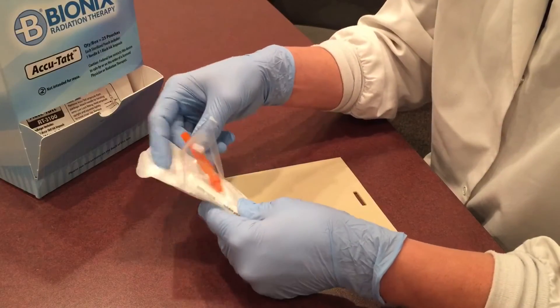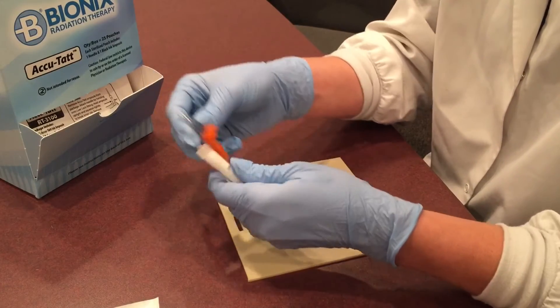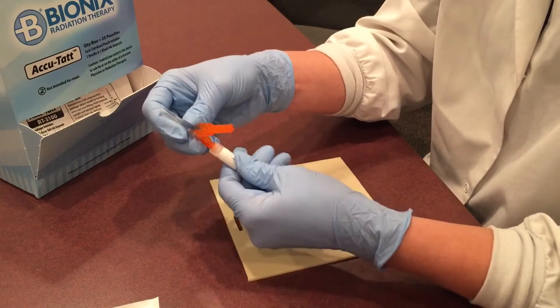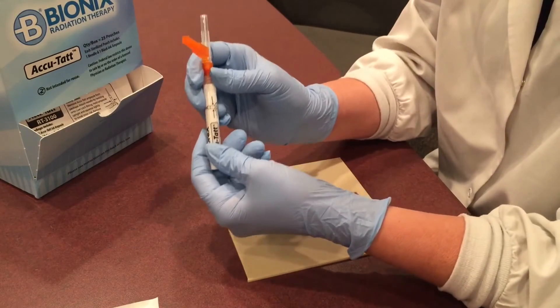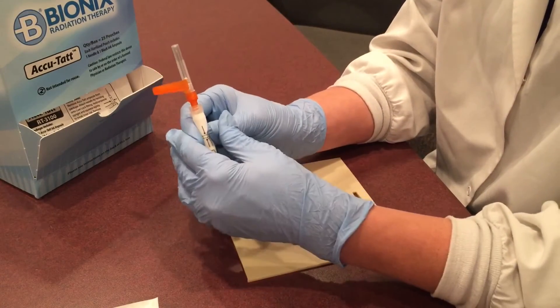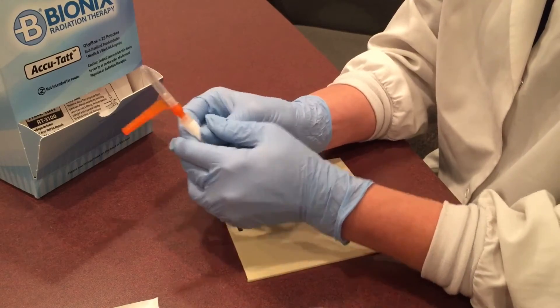I'd like to demonstrate how to use the AcuTat. Attach the needle to the ampule. Shake the product. Next, as indicated on the ampule, you want to break the inner vial. You do this by firmly squeezing.